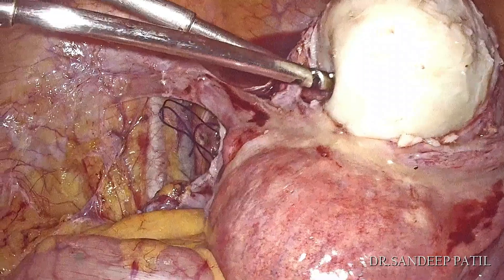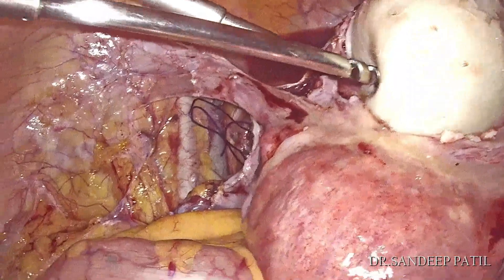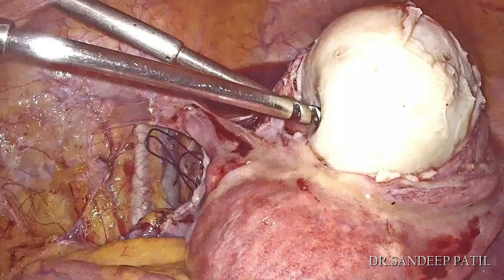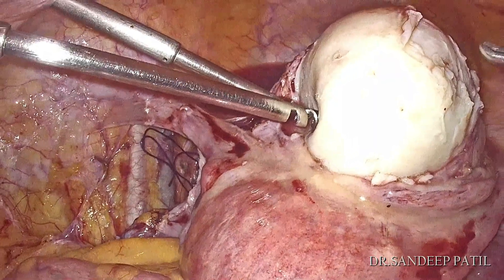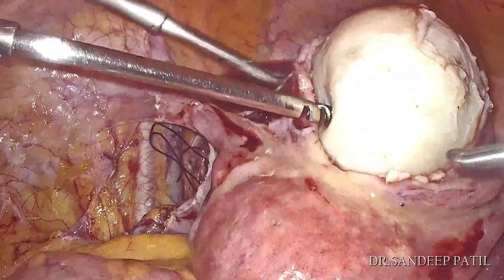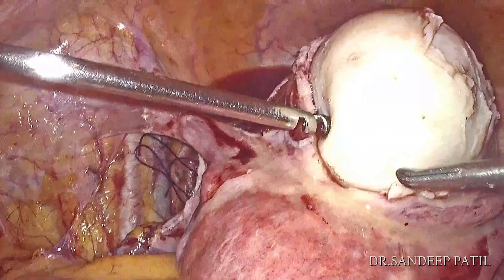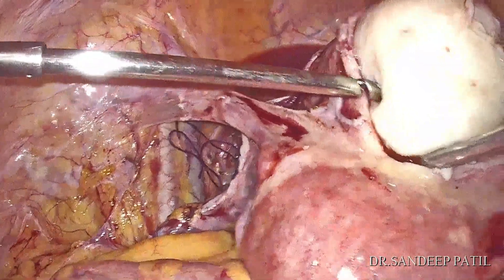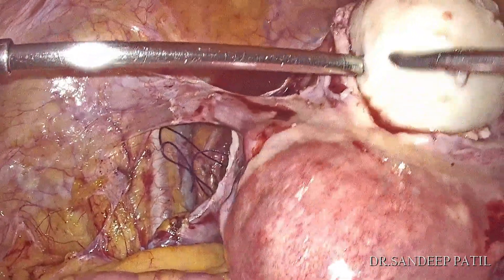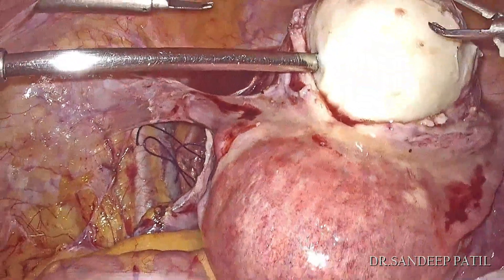If it is not damaging the ureters directly, there are chances that the ureter may come in our ligatures during suturing of the myoma defect.